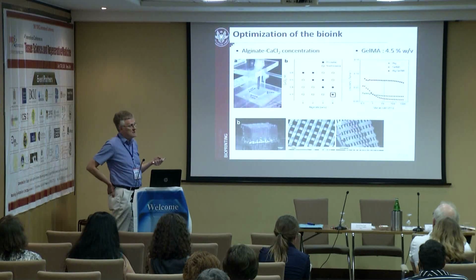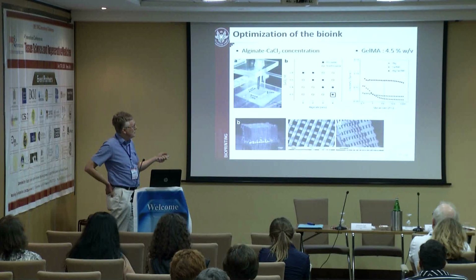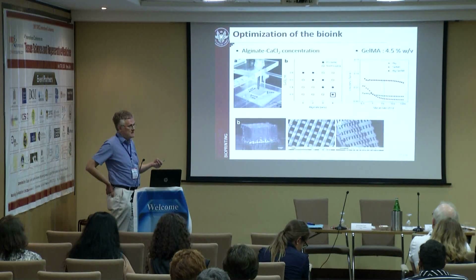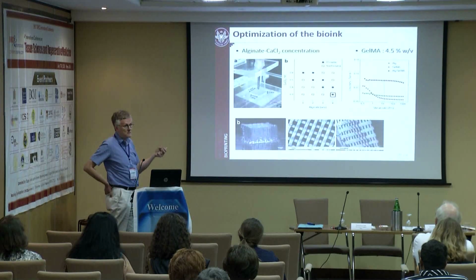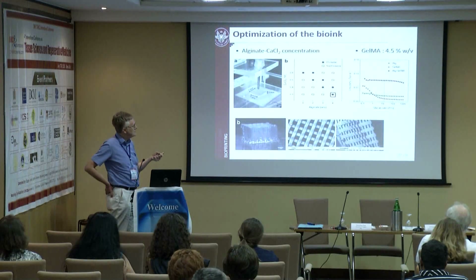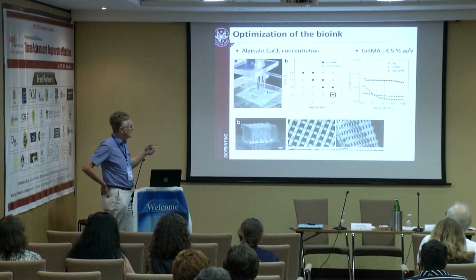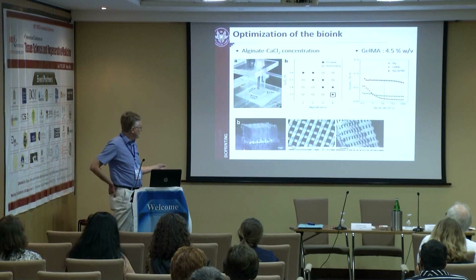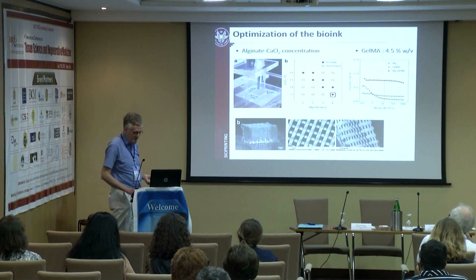But a high viscosity of the solution may hamper the homogeneous dispersion of a high concentration of cells. On the contrary, in our case, the low viscosity of the solution facilitates the dispersion of cells at a concentration of the order of 10^7 cells per milliliter. So here is reported the bioprinted scaffold in the swollen state, and here the relative SEMs.